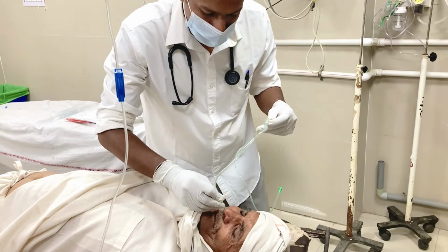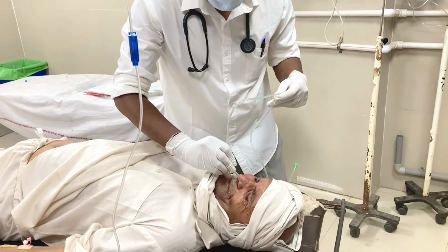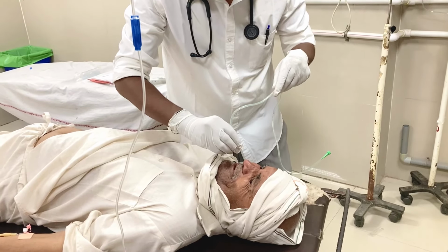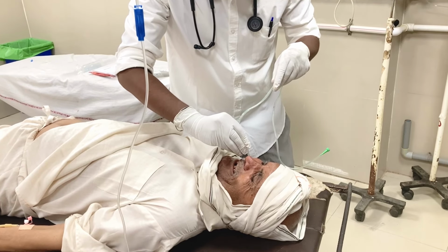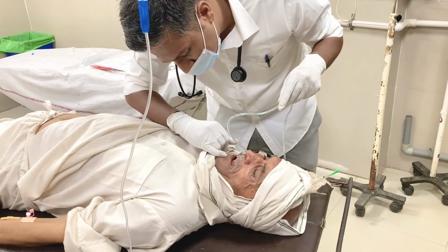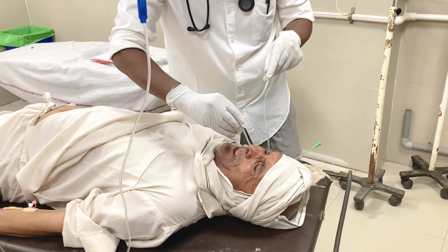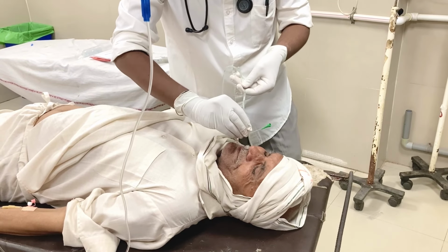So this is the most uncomfortable part for the patient. If resistance is met, just try rotating the nasogastric tube, which can aid the insertion. You need to avoid forcing the tube if significant resistance is encountered. If the patient becomes distressed, pause to give them some time to recover, and intermittently inspect the patient's mouth to ensure the nasogastric tube isn't coiling within the oral cavity. The patient must be encouraged and guided to swallow this tube, which will decrease the resistance.